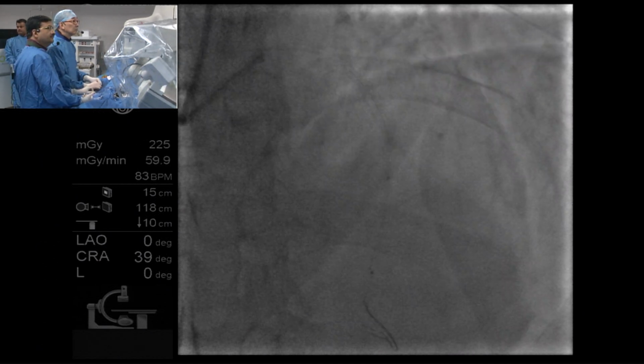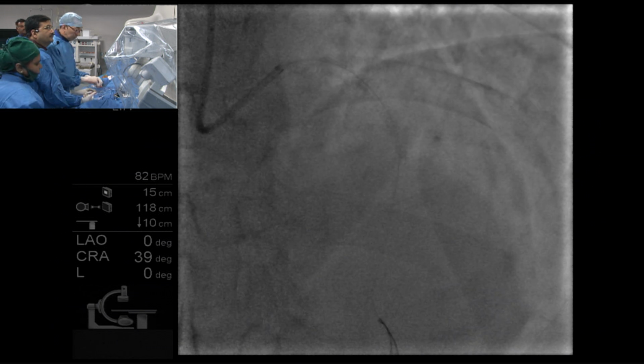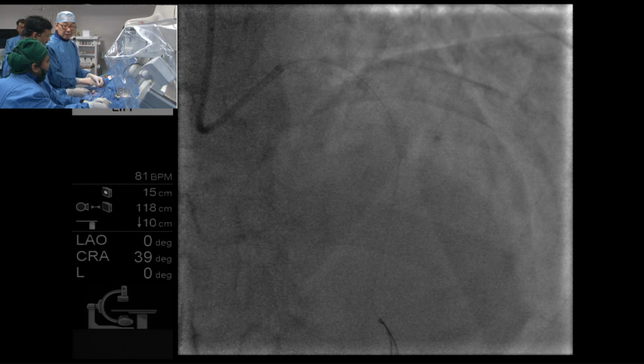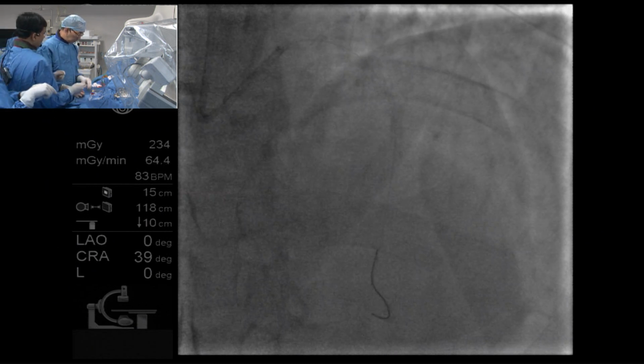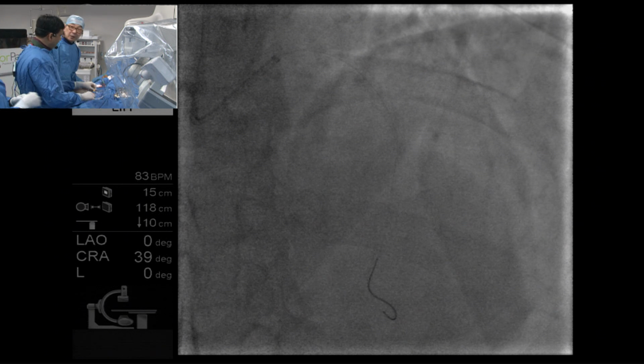What are the advantages and disadvantages of the two different IVUS systems? By OCT we can measure the calcium thickness. I'm asking about conventional IVUS versus Volcano with the virtual histology results.